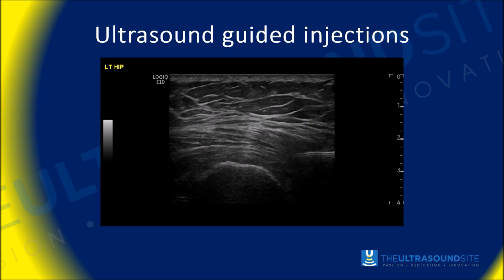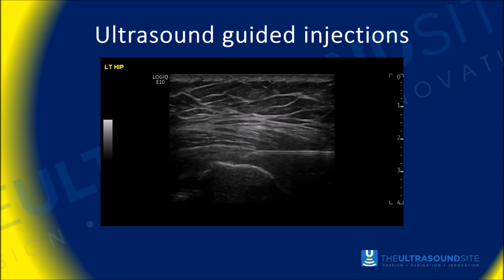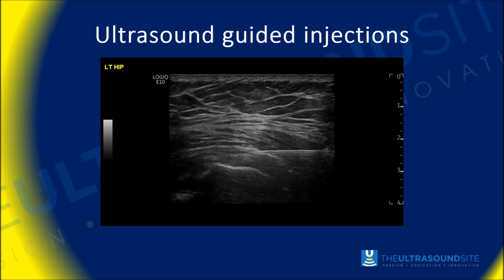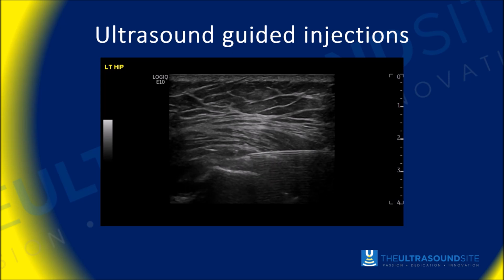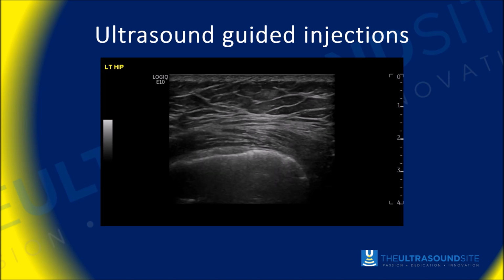What it also does is it allows us to survey the area, to demonstrate that we are sure that there are no associated sinister pathology, lumps and bumps, vessels, nerves, etc. in the way of our injection. So in other words, we're not piercing through anything that we wouldn't want to as part of our injection procedure.